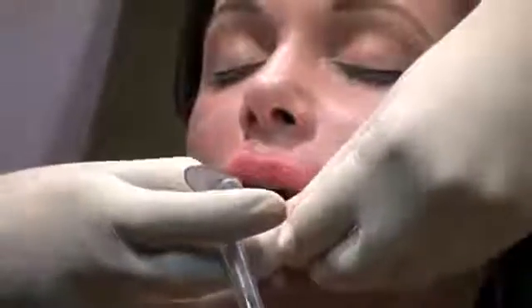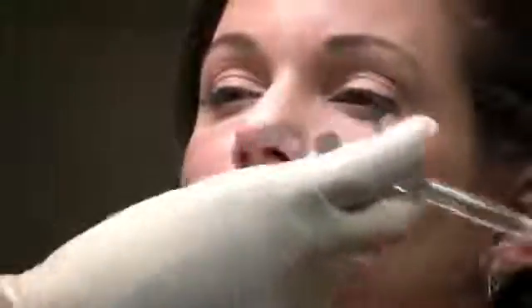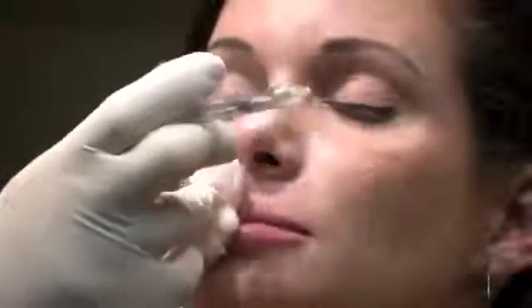But we're not quite done yet. After I smooth it out, I have them hold their lips together. I take a step back to get a better look. They look very symmetric. I like to overfill it just a little bit because it loses its volume. Just two little areas where I see a slight little shadow. Filling those out, and you can see this is a different technique. It's a perpendicular injection.